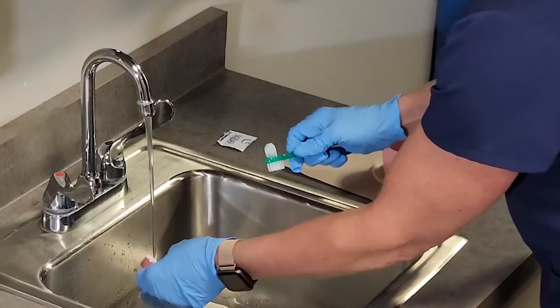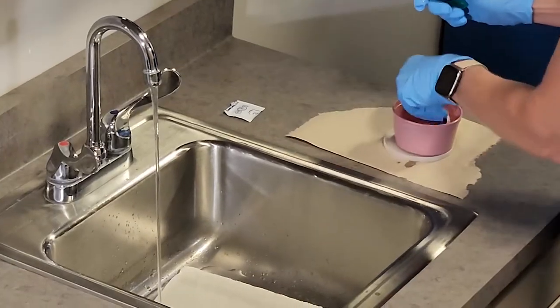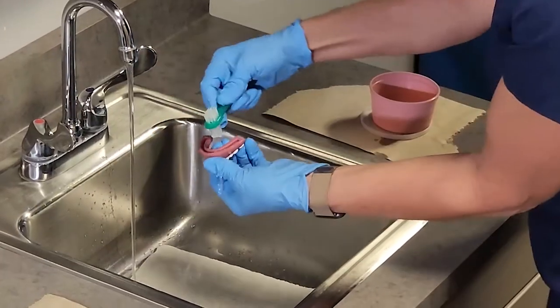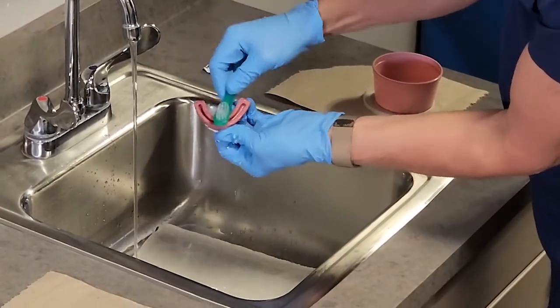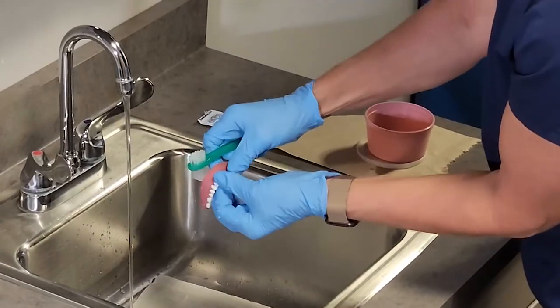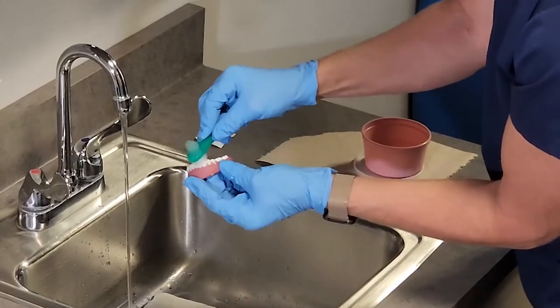I'm going to rinse those and set that on my clean barrier. This is the lower denture because it fits around the tongue. I'm going to take the long part of the brush again and go in that groove that would go around the resident's gums, and then take the shorter bristles and clean the teeth.